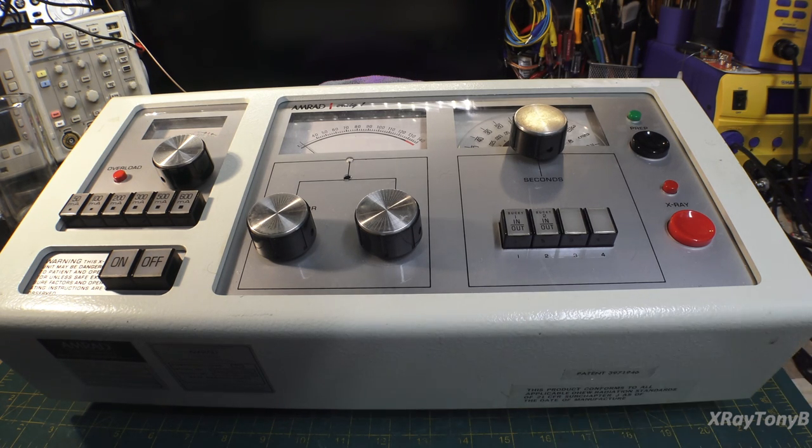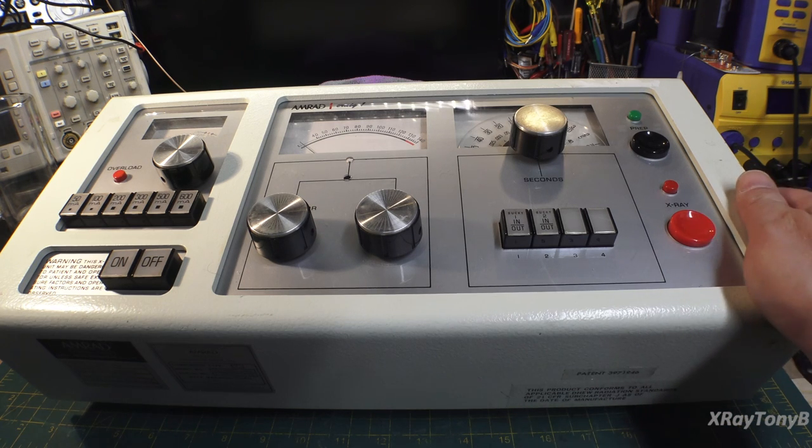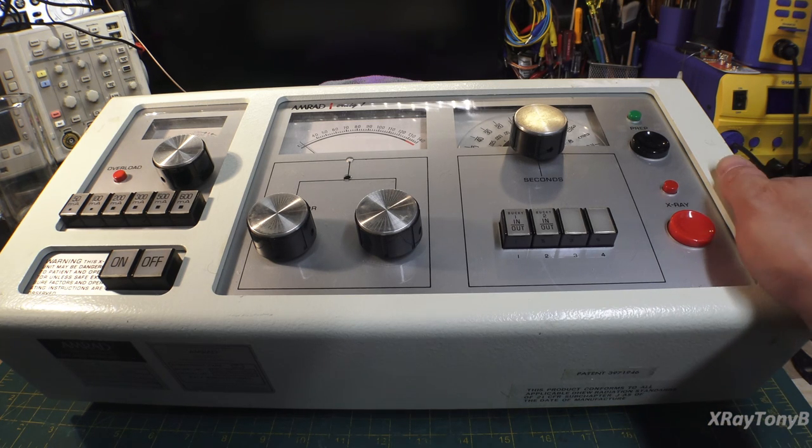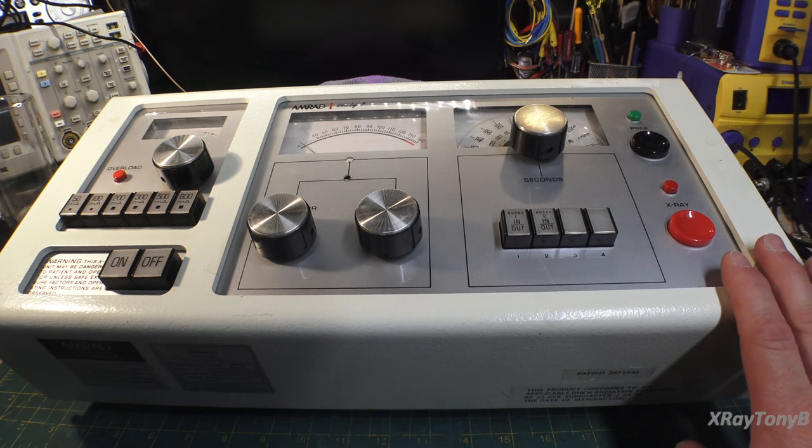This on top of my bench here is kind of an end of an era for me. So I thought I'd save this thing for my own little museum, just for my collection. This is a console off of an older X-ray machine, and it was built and installed in 1981, and we just pulled it out of service last week.